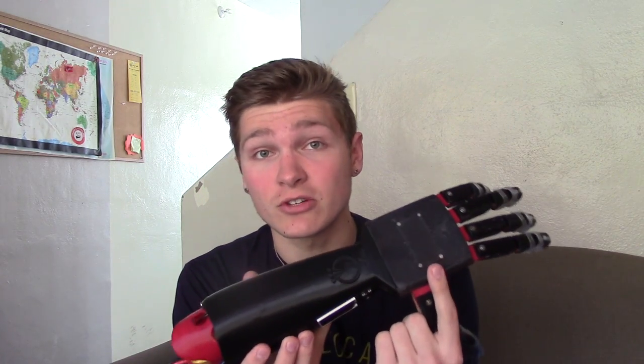In this episode, I'm going to show you how I got from the last version to this one. This is the final version of the Atlas Arm, aside from some minor tweaks. Some of the main things that are different about this from the last version is that it uses a DC motor instead of a servo. It also has a built-in screen and joystick for controlling the hand.